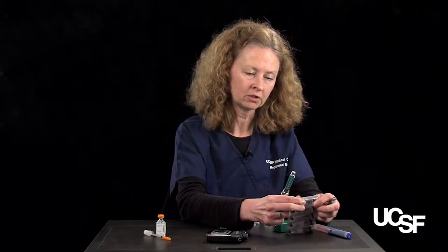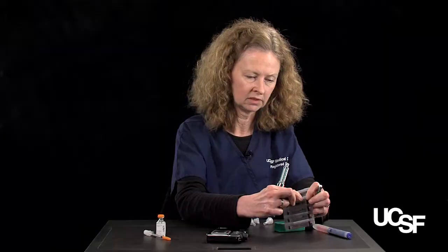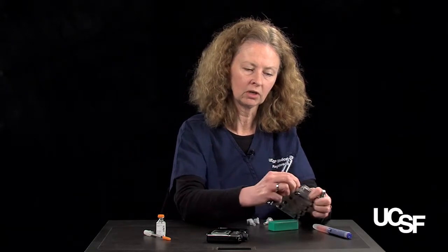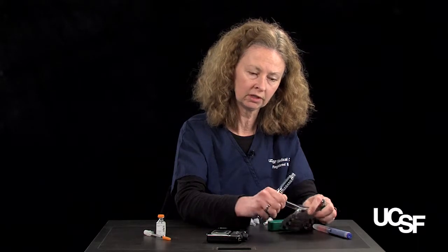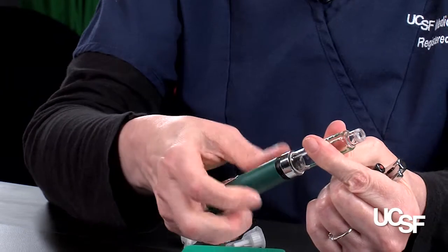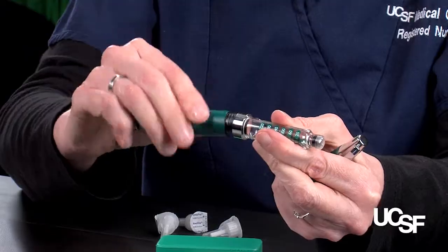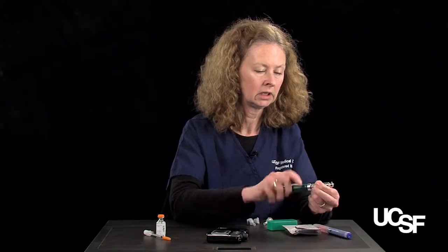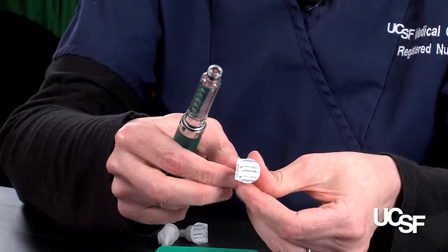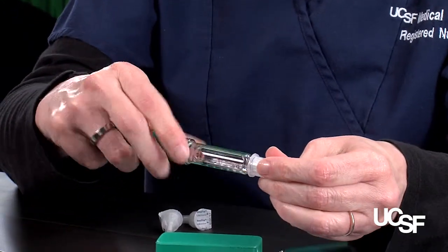When the patient picks up their prescription from the pharmacy, they will get 5 cartridges of insulin. In this case, this would be Humalog. Generally, all of these cartridges are kept in the refrigerator until the patient uses one. The pen comes apart here, and the cartridge goes inside. Attached to that, then, is a pen needle. So there's a paper back, and that just screws together.